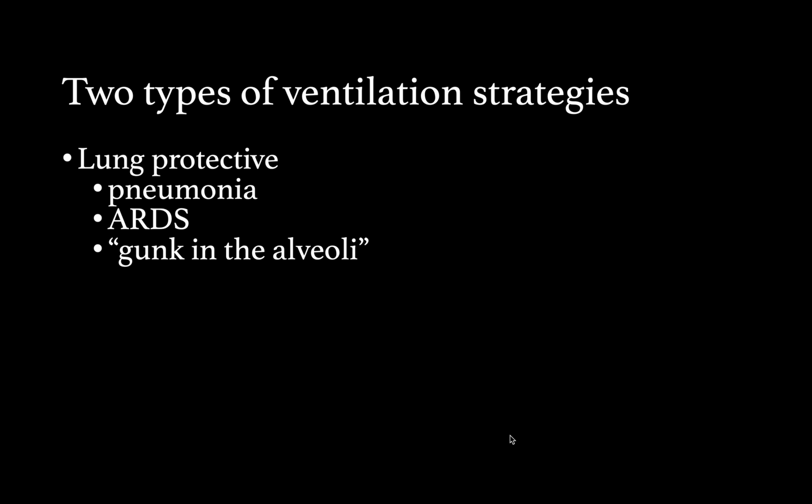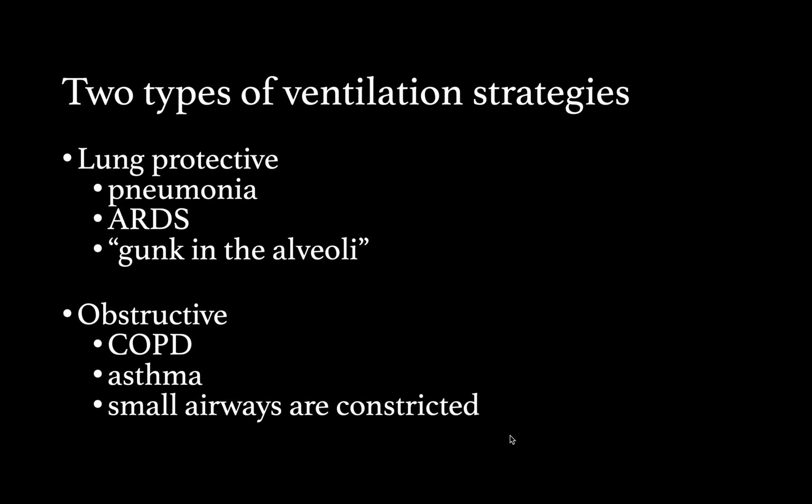So, what do we want to take home? We want to remember that there are 2 types of ventilation strategies for 2 separate types of pathologies. Pneumonia and ARDS are the prototypical gunk in the alveoli pathologies. These are the patients in whom we use the lung protective strategy. Obstructive strategy is required for patients with COPD and asthma. These patients have constricted small airways which limit the movement of air out of the lungs passively.